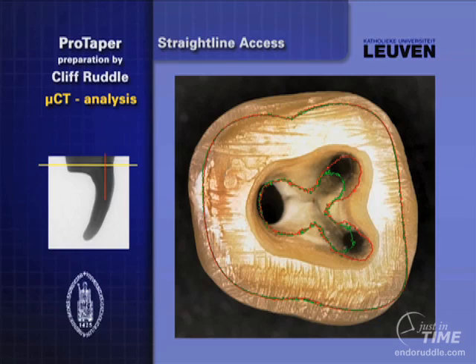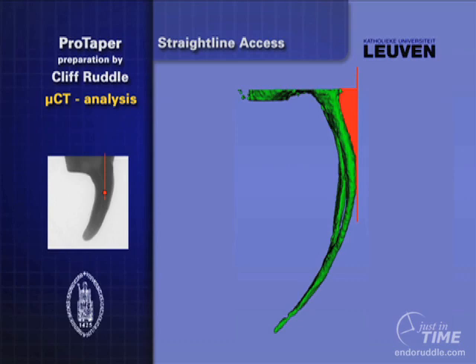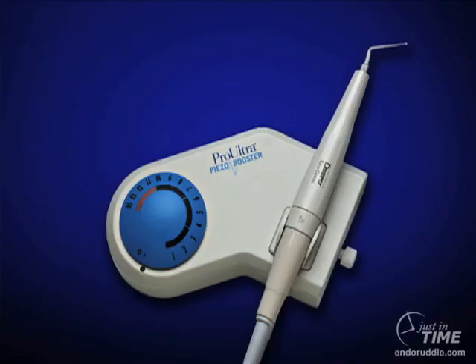That's all done with either an auxiliary ProTaper Shaper X, or you can do it with an auxiliary X gates. And you can see the big work is done with a surgical length tapered diamond. So move your big axial walls with a tool that can do it efficiently, but drag your orifices and relocate those with either Shaper X or the auxiliary X gates. If you look at the micro CT, green is the original pathway coronally of the canal, red is the little job that we did with the tools just described.